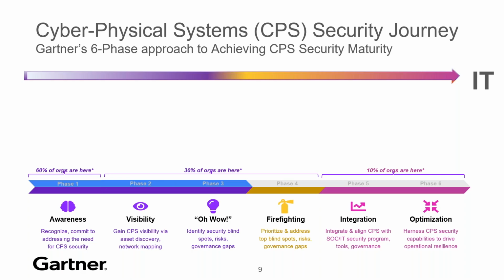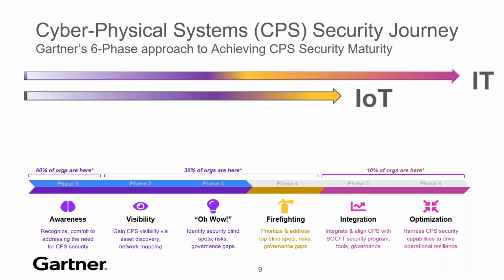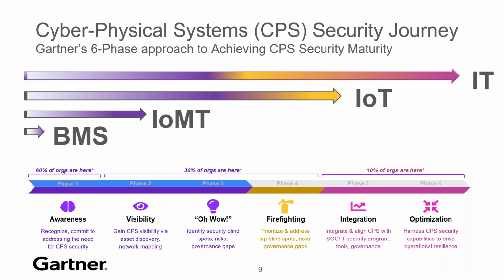So IT devices, they're pretty far down the road for the most part. IoT devices, still pretty far down there. Medical devices, the majority are still kind of stuck in visibility. They don't have visibility, or even if they get it, now what? We've got to start putting out fires. And building management systems: I presented at the ASHE conference, which is the facilities management association for hospitals. Not everybody even knew we had one of those. They're just getting started. They are definitely in awareness. Oh, it's not a cybersecurity, IT problem, right? Well, what if we decide we're going to update or patch something that brings your system down? Oh, well, that's a problem. We didn't want you to do that.